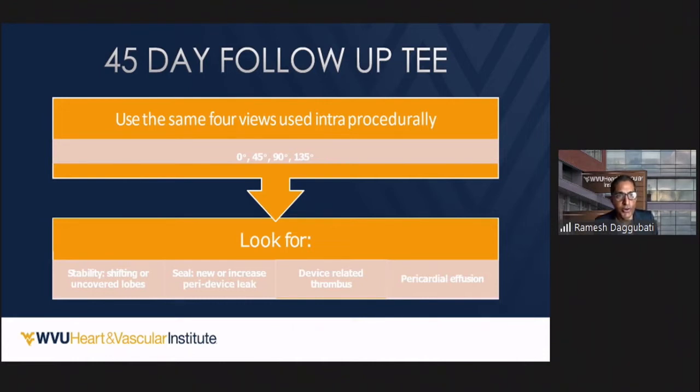So device-related thrombosis is best assessed, in my opinion, with the TEE rather than with the CT, unless your CT images are really very good. Each device might be slightly different. When we shifted from WATCHMAN to WATCHMAN Flex, our DRT rates went up from maybe 2% to 20%, because they were reading the material as a DRT, and that is really problematic.